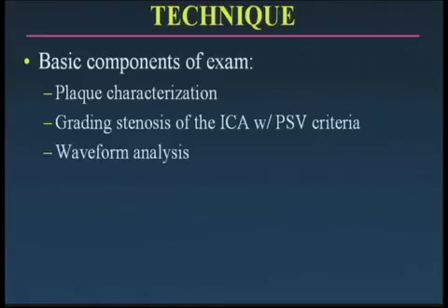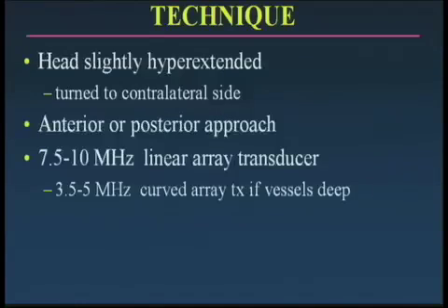There are three basic components of this exam. First of all, we want to characterize the plaque. Then we want to do the Doppler part of the exam to grade the stenosis in the internal carotid artery using peak systolic velocity criteria. And finally, we want to evaluate the waveform.